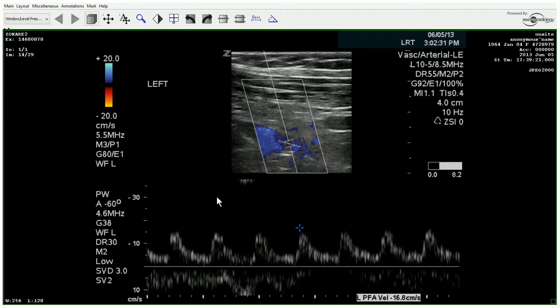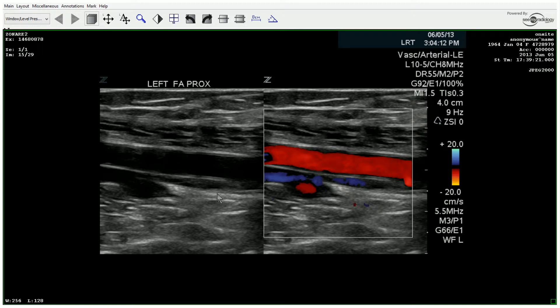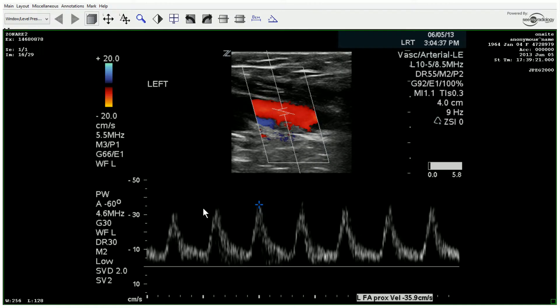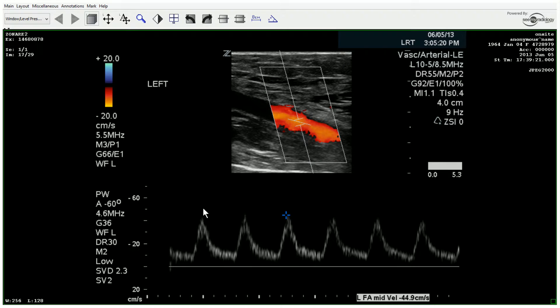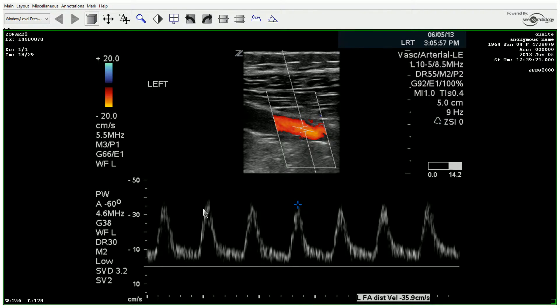Moving distally, we have the profunda and the proximal SFA, then mid and distal. Velocities are remaining fairly consistent. Waveforms are remaining fairly consistent with a nice open window. However, again, there is a delayed upstroke and downstroke.